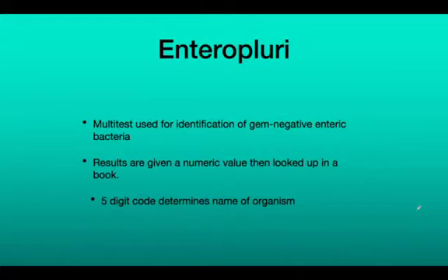Hello, welcome to our quick lecture on the Enteropluri. The Enteropluri is a diagnostic multitest that's used for identification of gram-negative enteric bacteria.